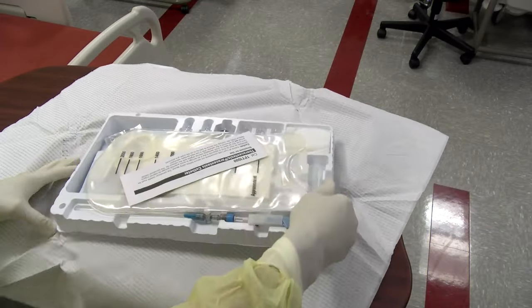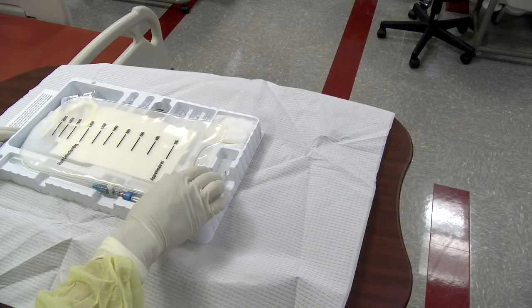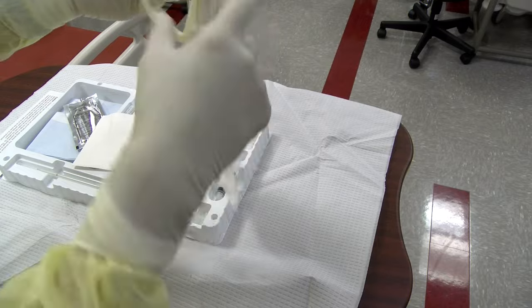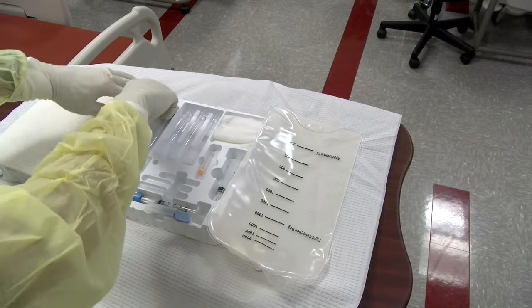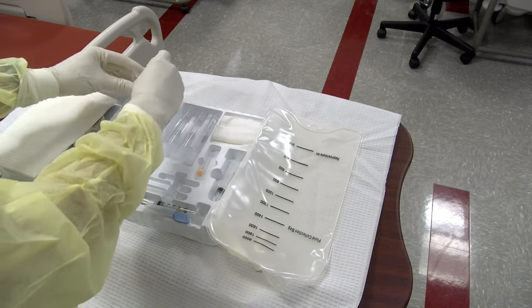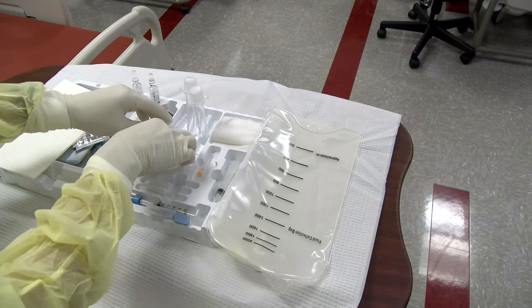Often patients requiring paracentesis have low blood pressure at baseline, and the removal of a large amount of fluid can precipitate worsening of hypotension. Limiting fluid removal to 5 liters can help reduce this risk, but severe hypotension should be addressed prior to performing the procedure.